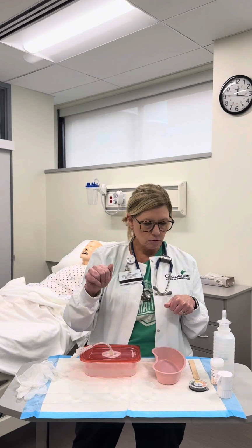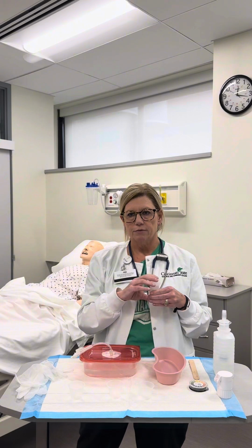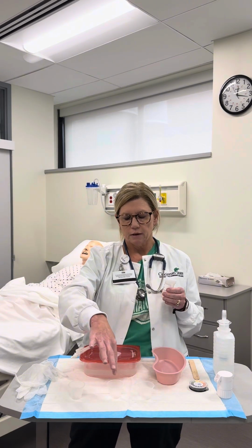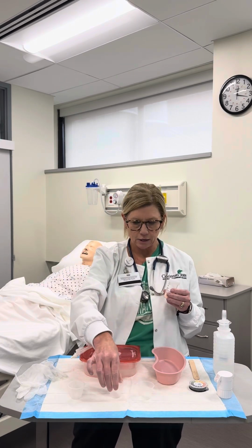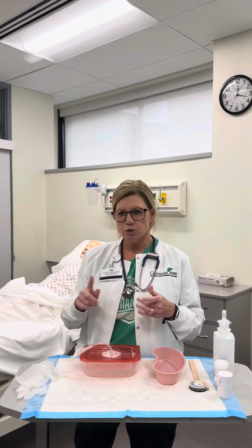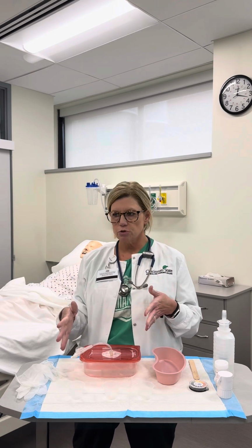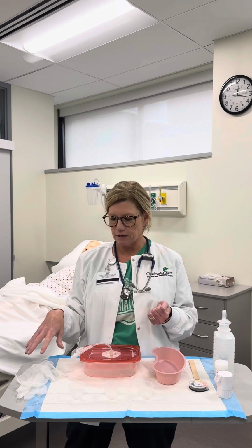Okay, so I've got my 3 medicine cups out. On the day of the skill, the medication will already be crushed for you. So you'll have a little bit of powdery crushed med in here, okay? So this will be my medicine. The first thing I need to do is check for placement and also check the residual. I want to find out how much is left in their stomach, maybe after their last feeding.